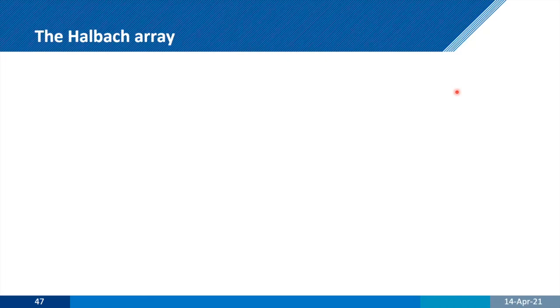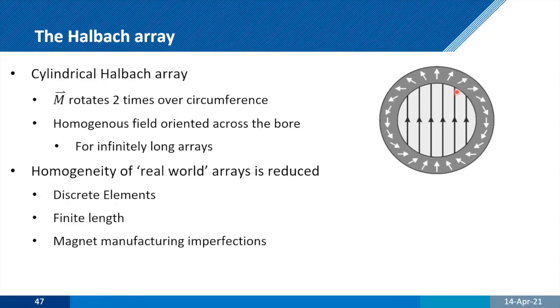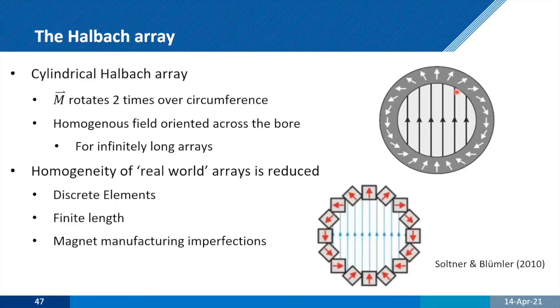let's have a look and see what we can get in terms of homogeneity. Okay? So the Halbach array, and of course Blümler down here essentially has thought about every single design of Halbach that there is. So really kind of a visionary in the field. He was applying most of this to chemical applications or plant applications or hyperpolarization. So everyone has been taking his ideas and basically scaling them up.